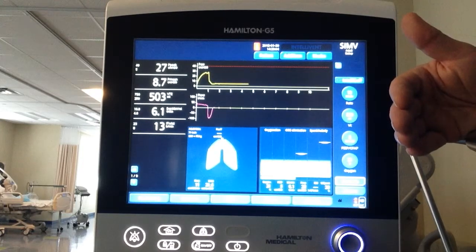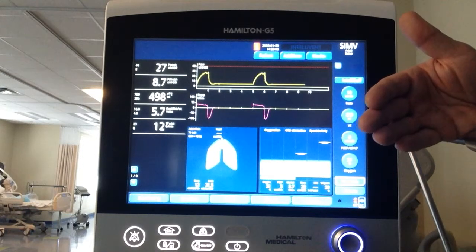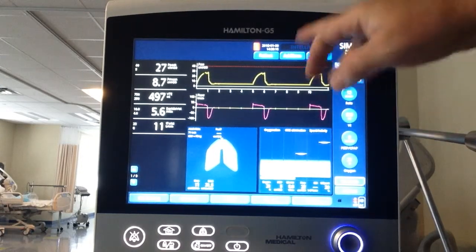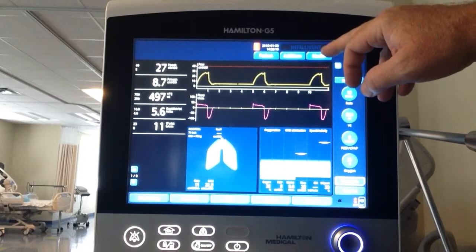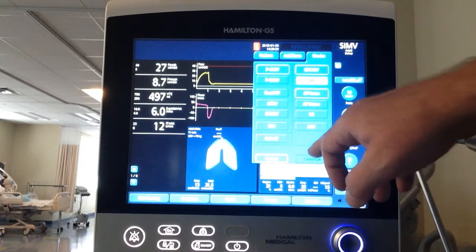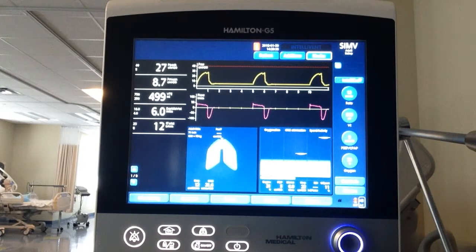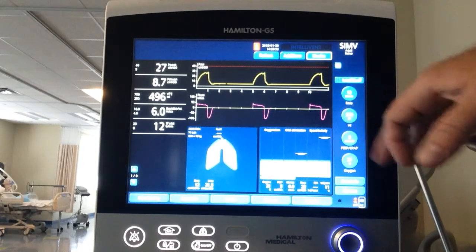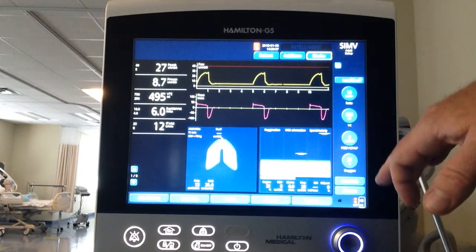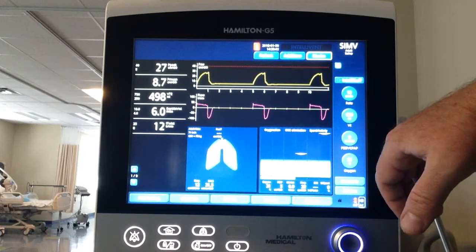Depending on the mode, it will be either a spontaneous breath or an assisted breath. If the patient doesn't make an effort it's a mechanical or controlled breath. In assist control there are no spontaneous breaths - they're all assisted or mechanical breaths. That is the Hamilton G5. Remember: to get into the modes, just hit Modes, choose your modality, hit Continue, and control the settings - rate, tidal volume, PEEP, oxygen - right there.